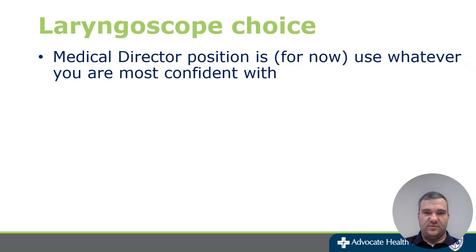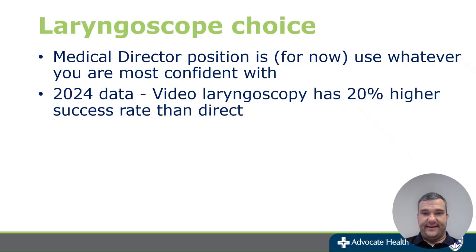Laryngoscope, I kind of covered this when we were showing the pictures before, but essentially our position is whatever you are most confident in. So direct versus video. I do highly recommend video though if you are carrying it. It can't really hurt. It does increase your chances with that video aid, showing exactly what the tip of the blade is looking at over there. It does increase the first pass success pretty significantly with intubation. There you go, 20% higher success rate than a direct intubation.